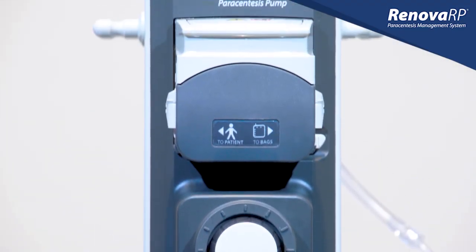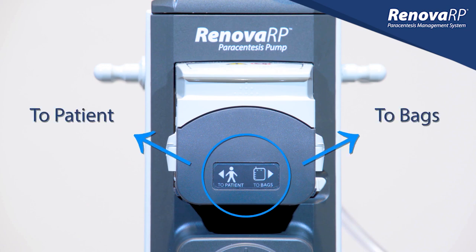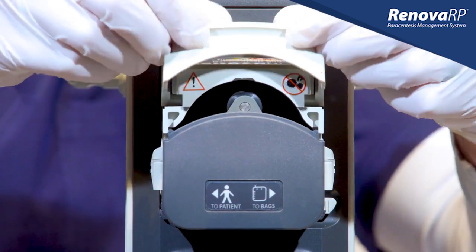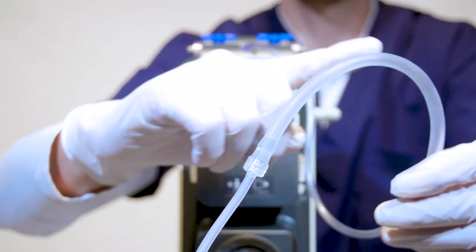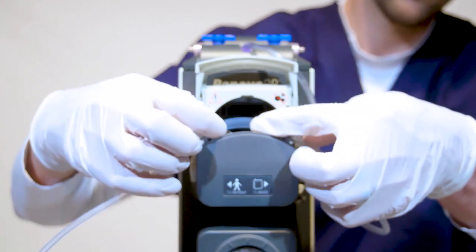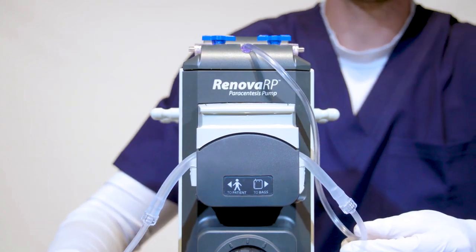Using the indicator on the front of the pump head, we can see how to properly load the tubing. When facing the pump, we see that the tubing should go to the bags on the right and to the patient on the left. When we lift the flip top of the pump head, we're able to see the rollers which are responsible for moving the fluid along as they contact the tubing. The thicker part of the tubing is designed specifically for this purpose. Center the thicker portion of the tubing over the rollers and close the flip top.